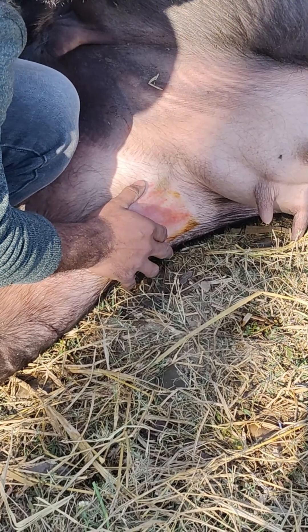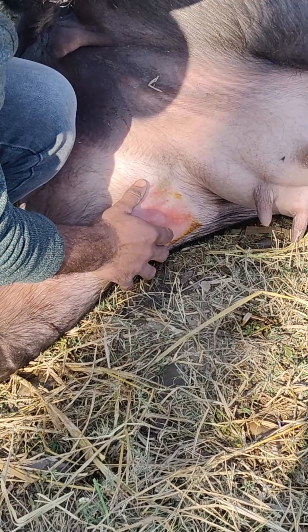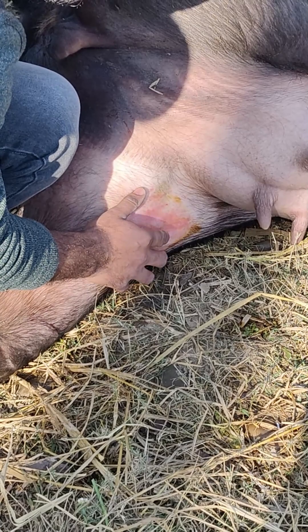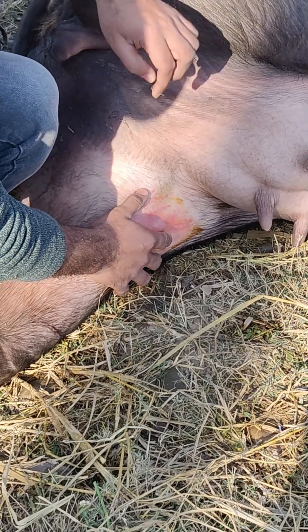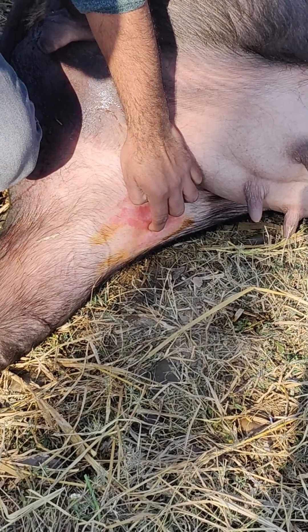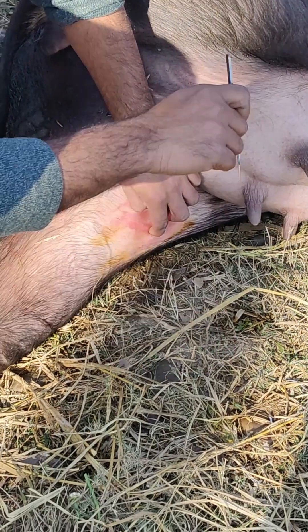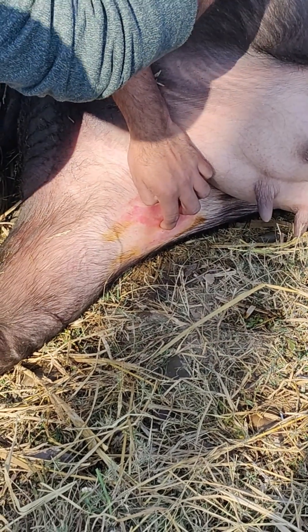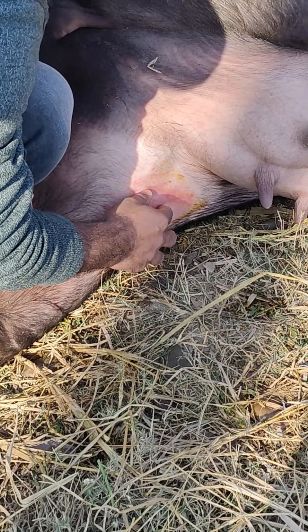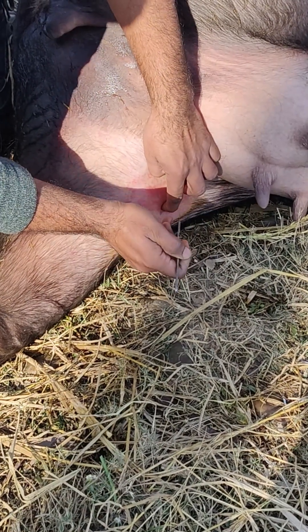Now after confirming the exact location and position of the medial ligament by placing the finger, with the help of a blade — number 11 — it is inserted at the depression site and the medial ligament is cut. The blade should be placed from lateral to medial direction to prevent accidental incision of the middle ligament, which can lead to permanent lameness of the animal. This should definitely be avoided in all situations.